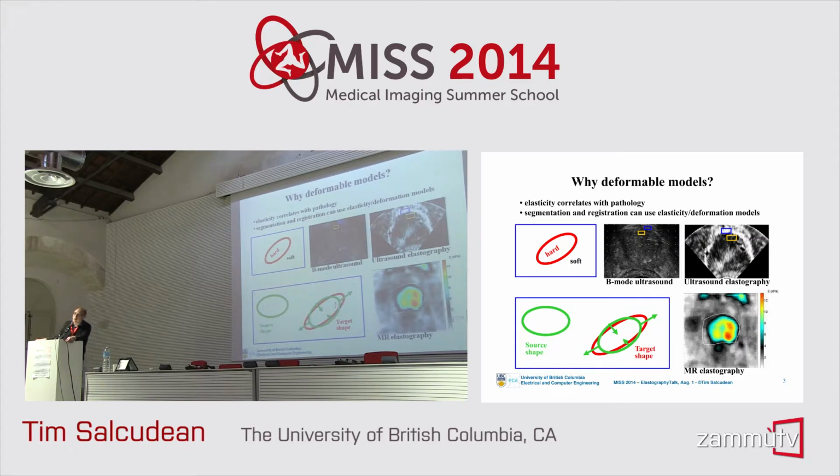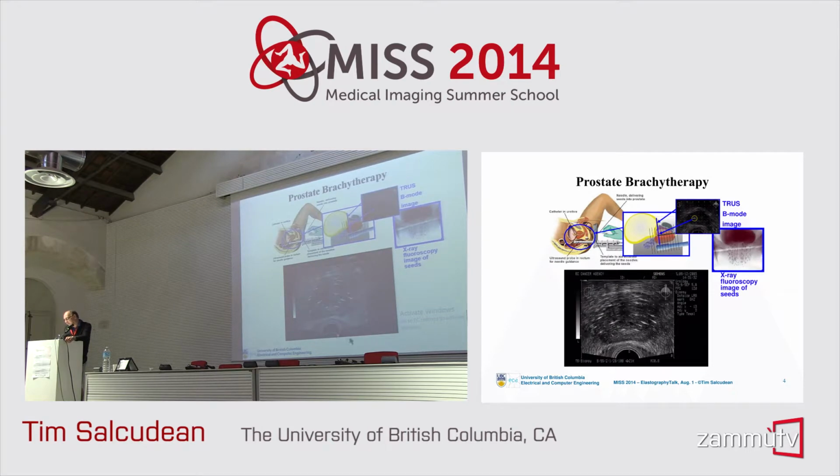And finally, what I think is also going to be a huge hit is the fact that elasticity is common across modalities. If you find elasticity in MR and you can image it well enough, and you find it in ultrasound, then you can use elasticity as a way of registering those images. You don't need to look at mutual information or feature points and so on. I think that's very exciting to me.